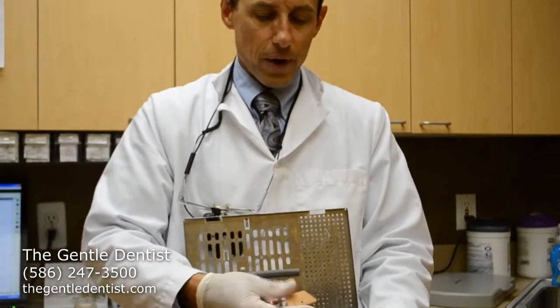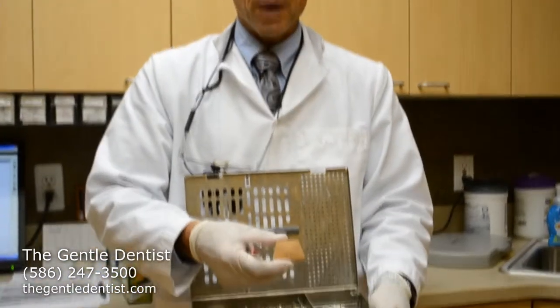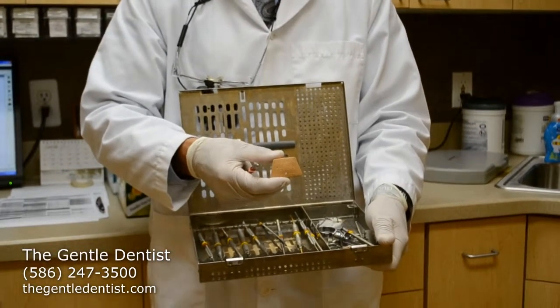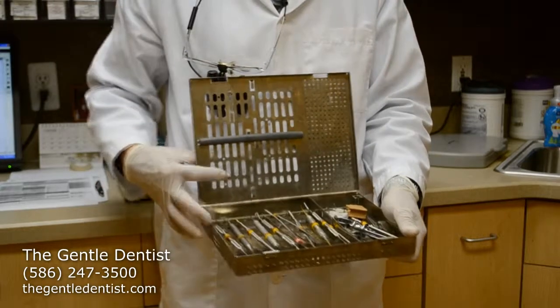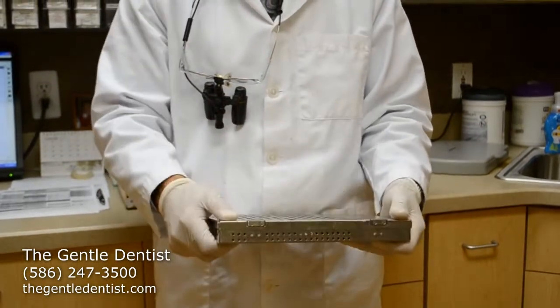This is also our bite block. A bite block is used to help hold and support your jaw while we do treatment. And there's a whole host of instruments in this cassette here. So what I wanted to do is show you how it's processed.